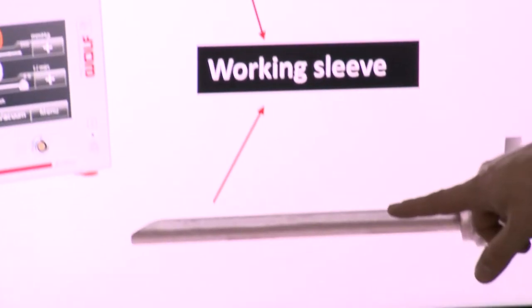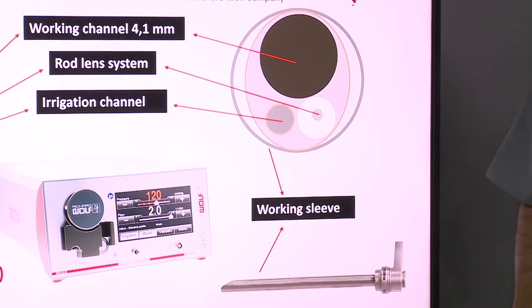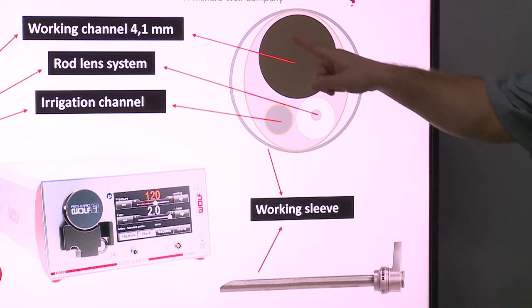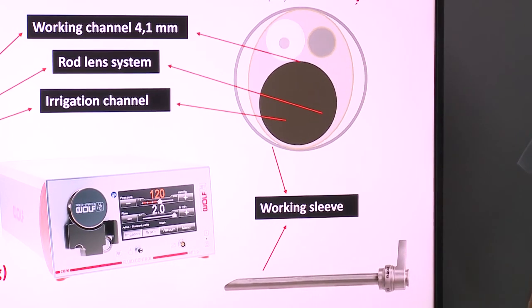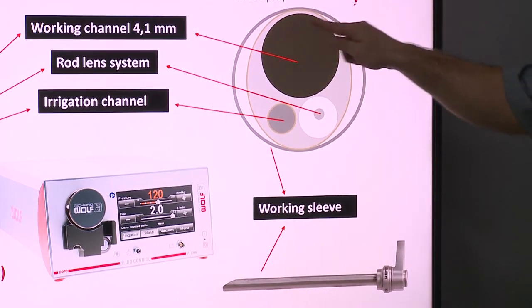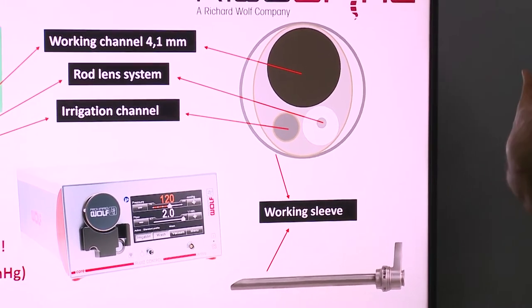As we talked about in the operation, we are working with the sleeve. The sleeve is a round shape, as you see here. But the optic which we use is oval shaped, like this. Then you always have this space during the operation. That's why it is very important to get outflow.